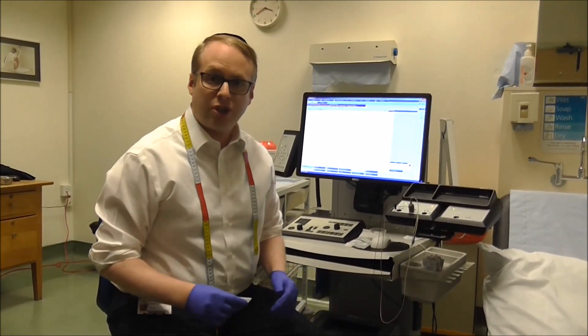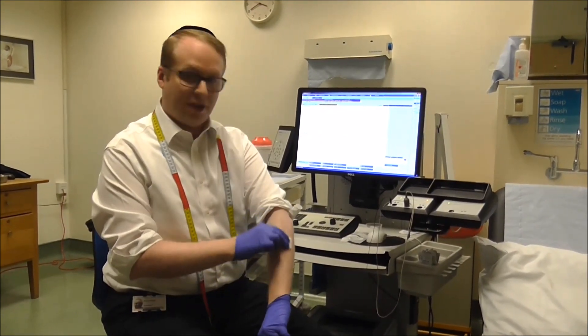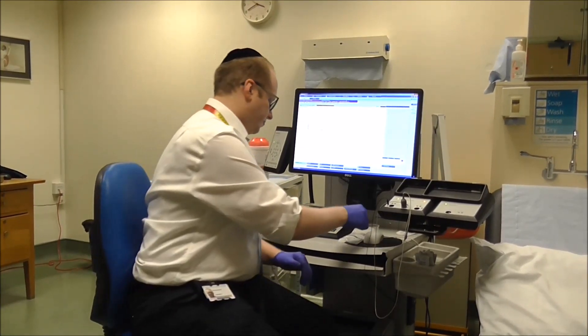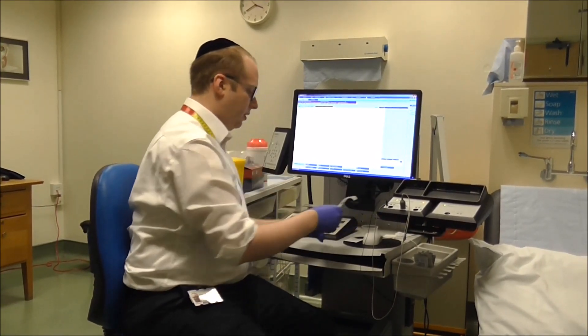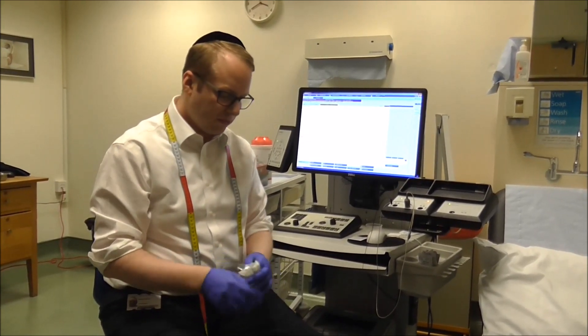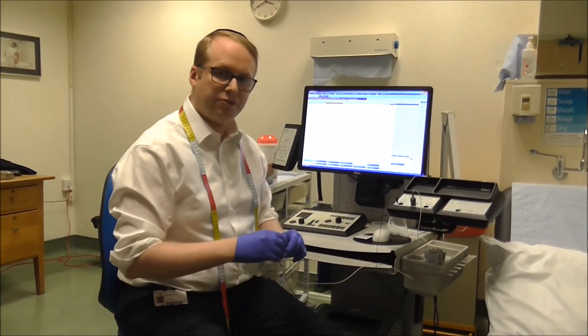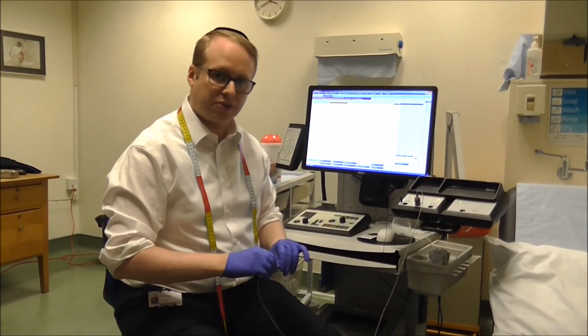I'm now going to show you what an EMG looks like. First of all I'm going to clean the skin with an alcohol swab. I'm then going to use one of our sterilised disposable needles. This is a very fine wire which just goes underneath the skin.